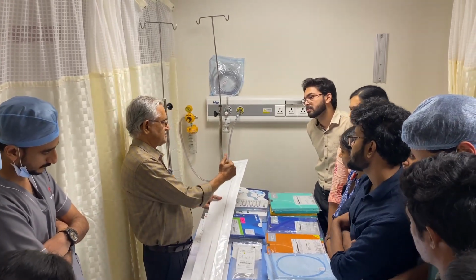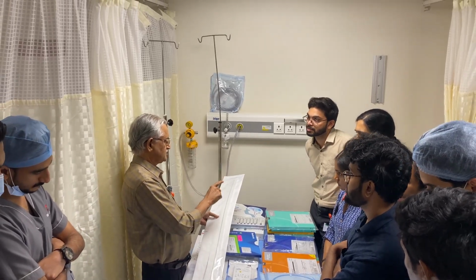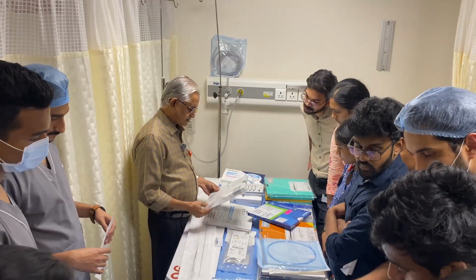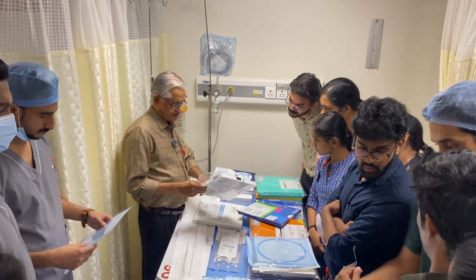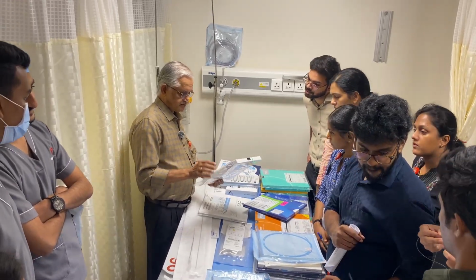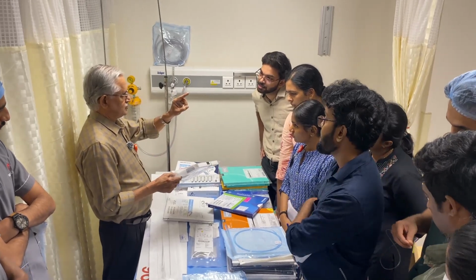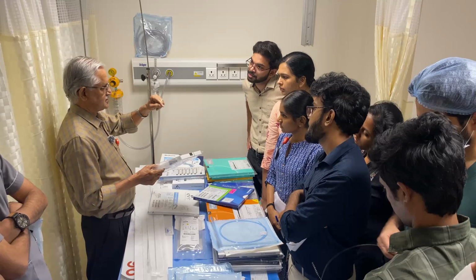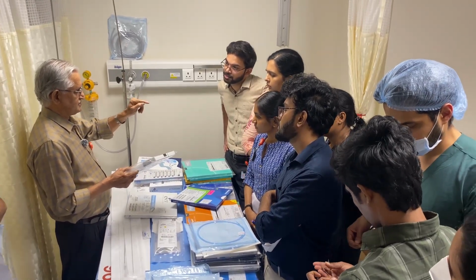Generally it will be kept at the ostium, at the aortic origin, and through that you pass a softer catheter. This is the neurovascular microcatheter, which is 115 centimeter. This microcatheter will go to the site of occlusion, the stroke occlusion, whether it is in the proximal ICA, proximal MCA, or proximal ACA, wherever it is.